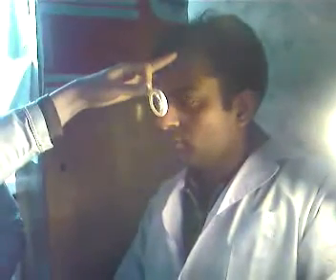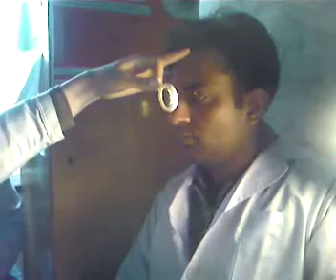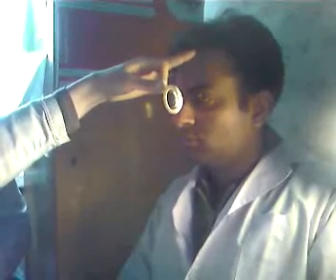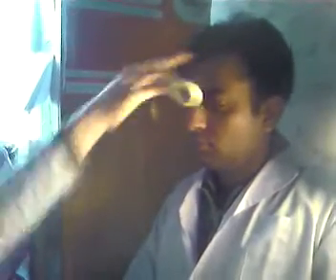Look on my ear now. I aim the red fundus reflex and bring the lens to this eye. Initially I see nothing, then I adapt and slightly change the direction of my light — here I see it. At approximately this distance — not closer, not further, approximately at this distance — I see the optic nerve head.